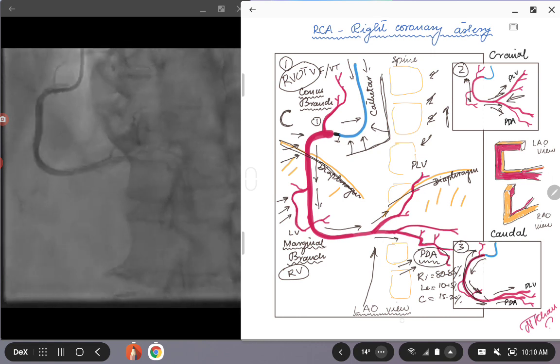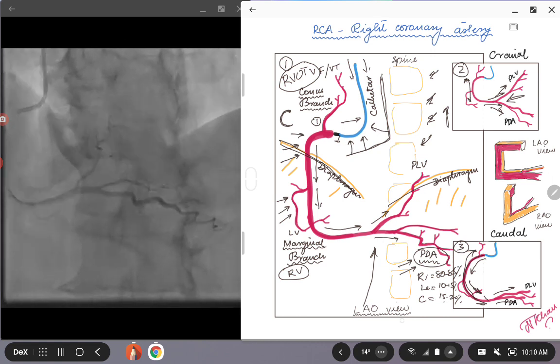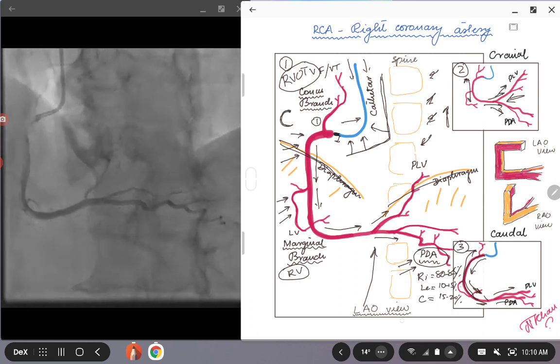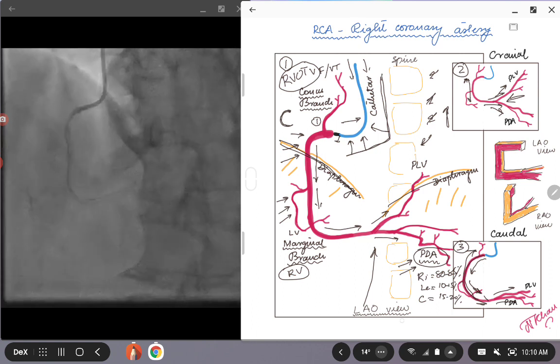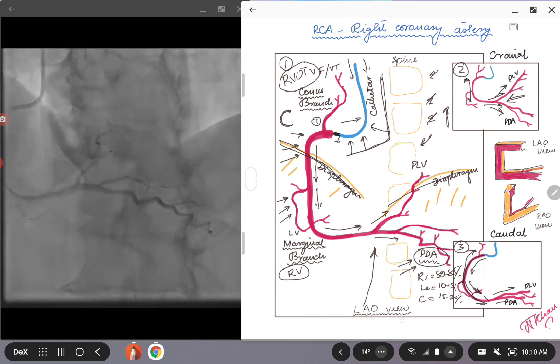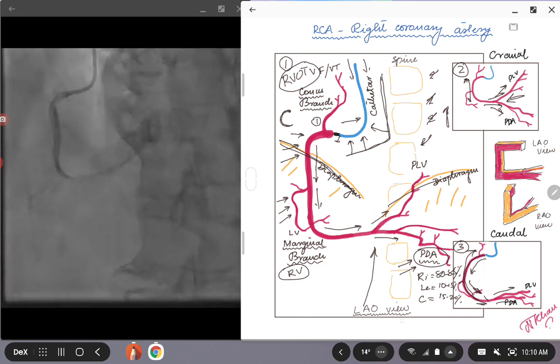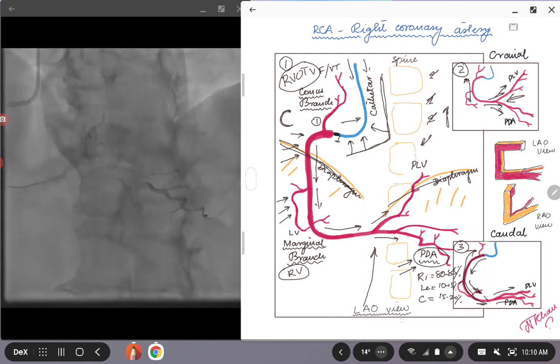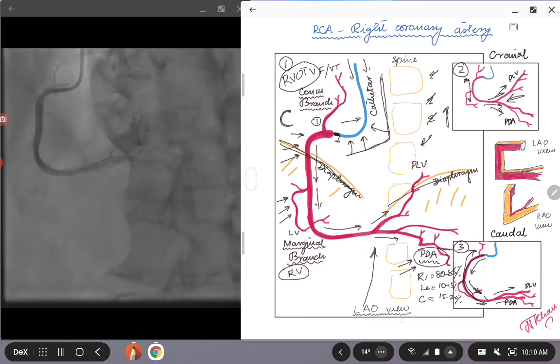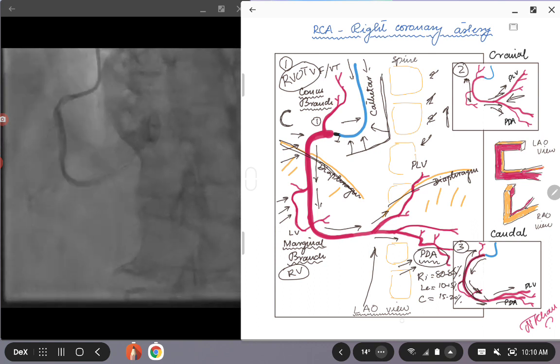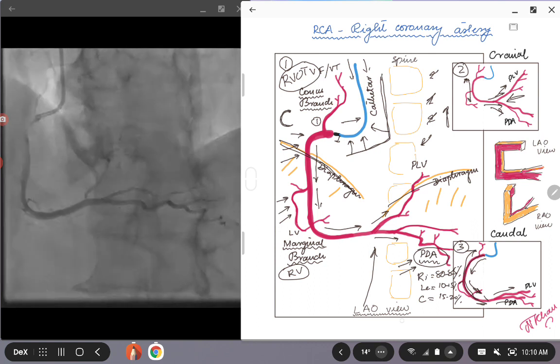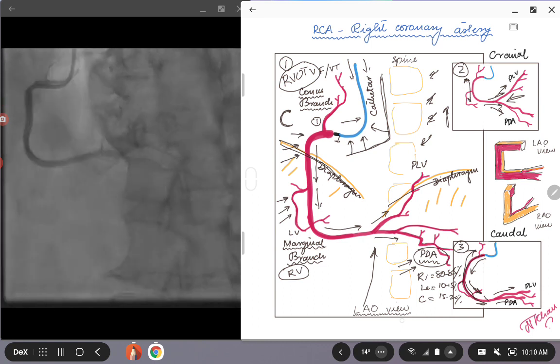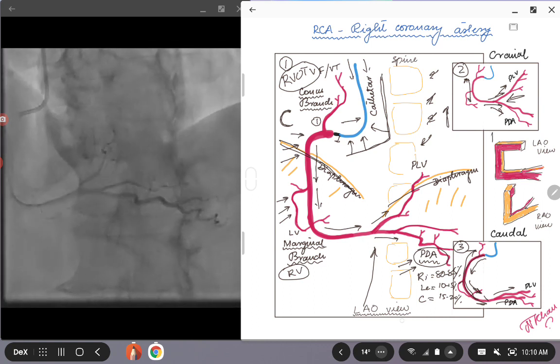Here, the RV marginal branch, if you see, probably comes in the middle of the right coronary artery, goes like nine o'clock position, but you will see that it kind of overlaps. Once we will be discussing the RAO view for the right coronary artery, you will see how nicely the branching vessels, RV marginal, PDA, and PLV are separated and easy to appreciate.